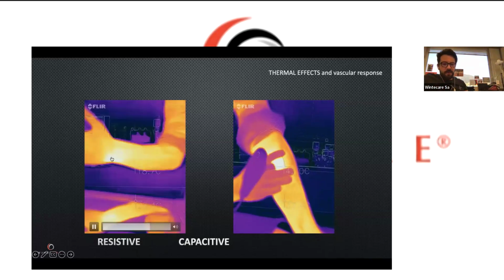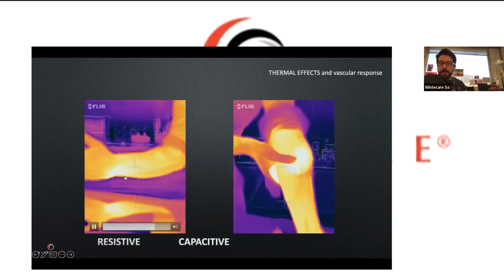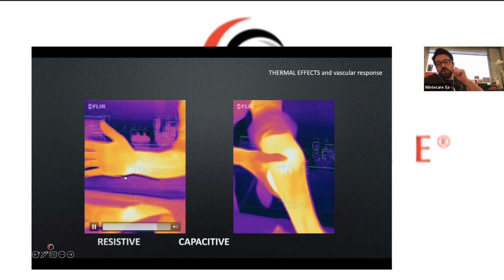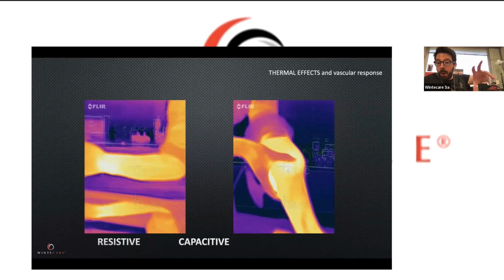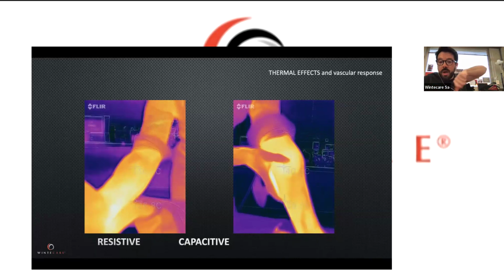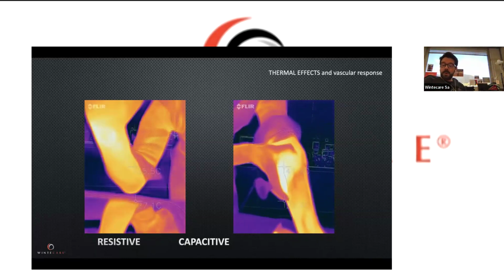Give me a few seconds. Okay, you see this line is a vein filled up with blood that is higher in temperature. To take into consideration, why? Because this means that we can work more on range of motion, on the viscoelasticity of the tissue, on the metabolic stimuli of the tissue.